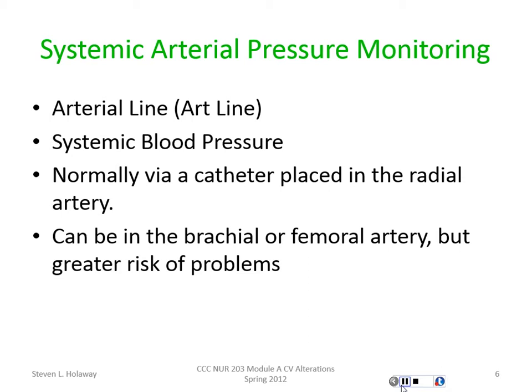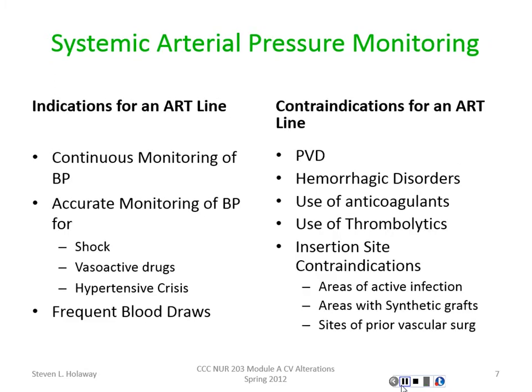That's really all an Allen's test is. But you will see the anesthesiologist, the nurse anesthetist, those people who are putting in these art lines, you'll typically see them check an Allen's test. Respiratory therapy, when they're drawing just an in and out blood gas, if they're drawing radial, they'll do that as well. So that's very important to check that circulation as you're going through.